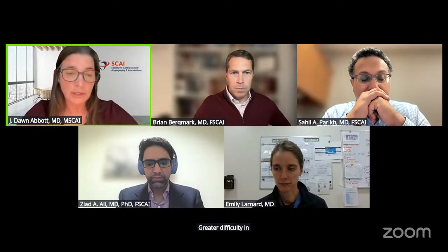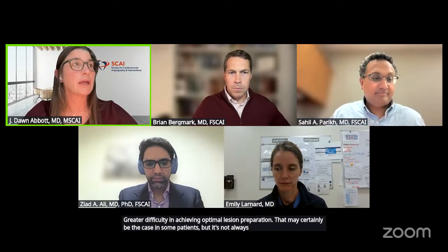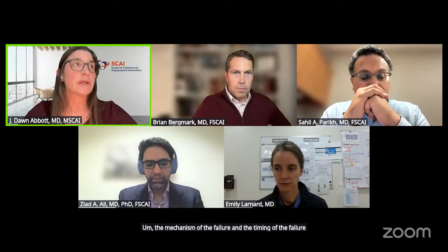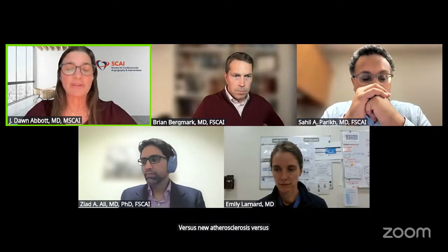I think the third option is probably the most important distractor, which is greater difficulty in achieving optimal lesion preparation. That may certainly be the case in some patients, but it's not always true. I would say that depends a little bit about the mechanism of the failure and the timing of the failure in terms of neointimal hyperplasia versus neoatherosclerosis versus degree of calcium.